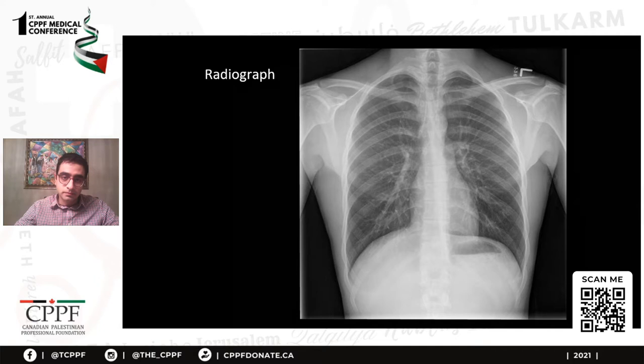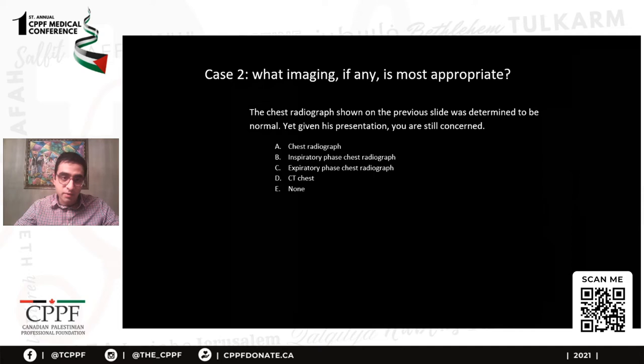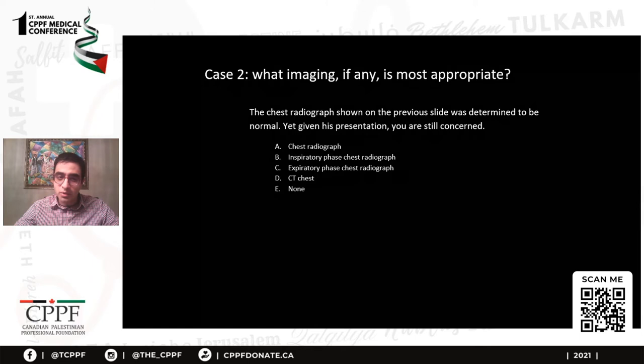All right, so the question is, the chest radiograph shown on the previous slide was determined to be normal. Yet given this presentation, you're still concerned. What would you do? Repeat chest radiograph, inspiratory phase chest radiograph, expiratory phase chest radiograph, CT chest, or none of the above. You have 30 seconds. I'll show you the image once again, but we know that it's normal.